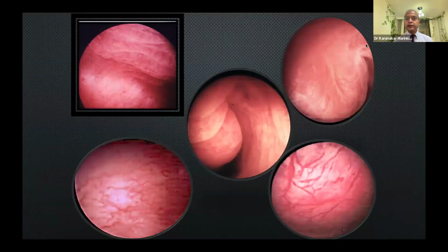And there are people where you do hysteroscopy, and you may find 3 submucous fibroids, such as this one. You may find a submucous fibroid which is completely cicatrized, which means scarred, almost like a burns injury. You may find a submucous fibroid with a surface epithelium, with vascular congestion, intermenstrual spotting, perimenstrual spotting. She may have a symptomatic submucous fibroid.